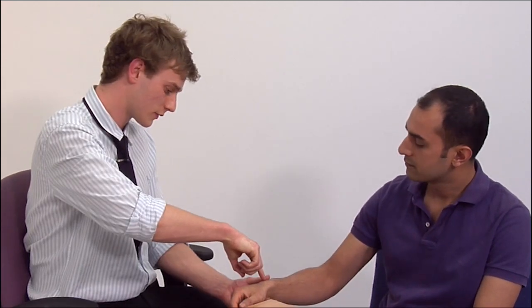Introduce yourself, correctly identify your patient, explain what you're going to do, and gain consent. An explanation should always begin by assessing the patient's current understanding and, in this case, current technique.